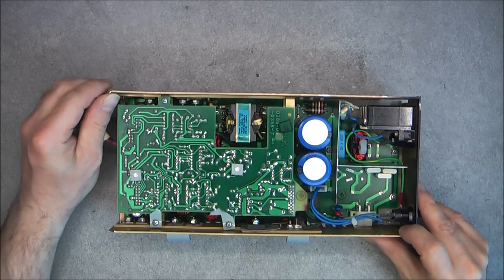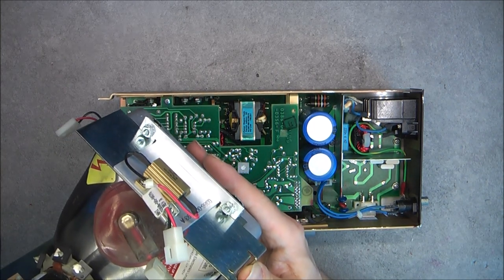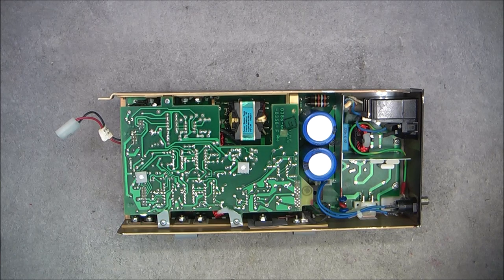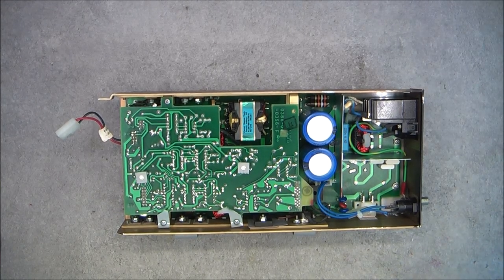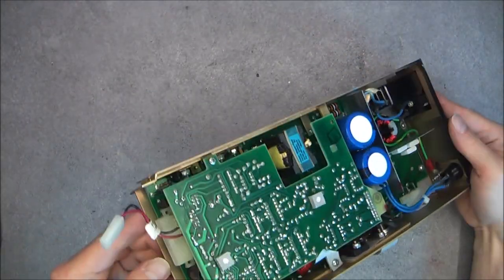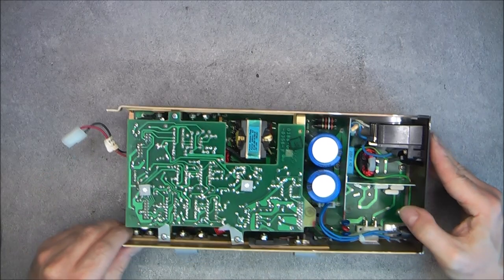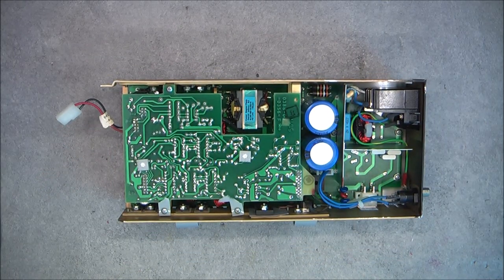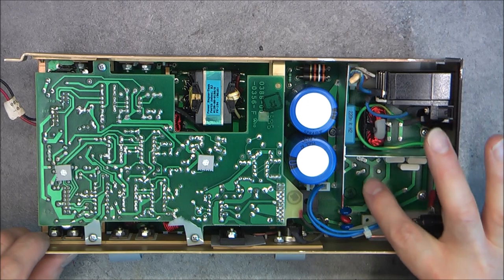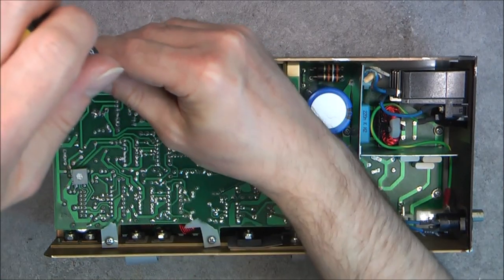Next, the power supply. So if you remember, on this connector from the power supply, we had the power resistor here secured to the side of the vacuum tube assembly, CRT, we will call this a CRT. So here we have in this aluminium frame a stack of two circuit boards that is apparently making a switch mode power supply. So I will zoom a little bit. You can see mains input, regular filtering, unpopulated parts here, high voltage rectifying and capacitors. So all your regular power supply stuff.